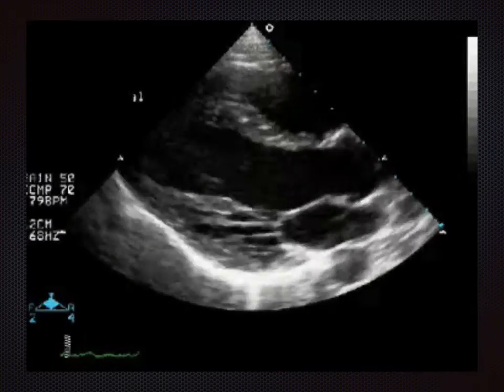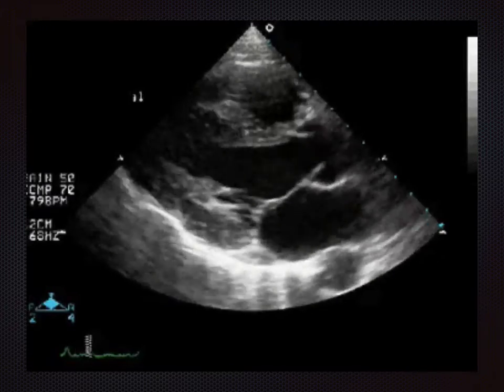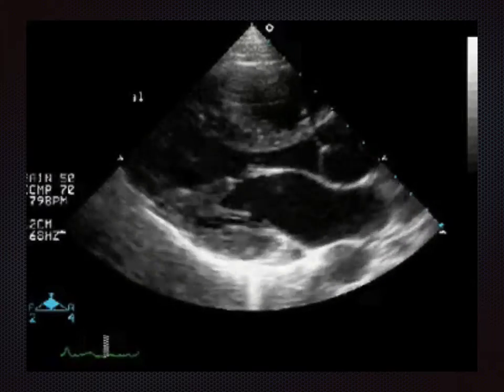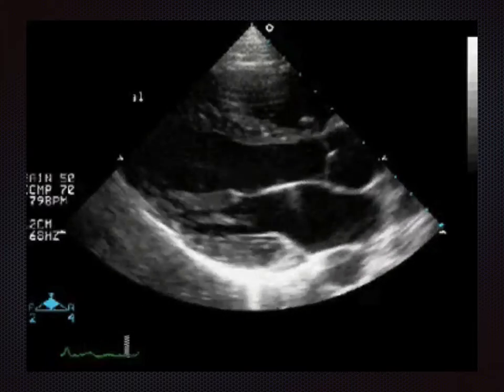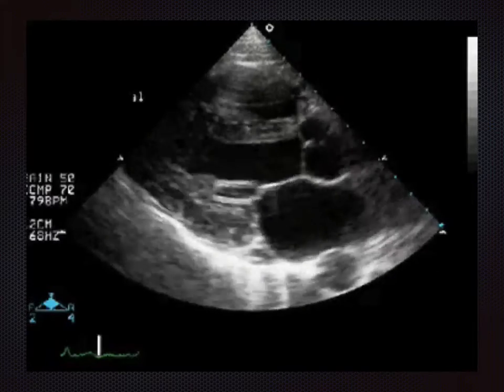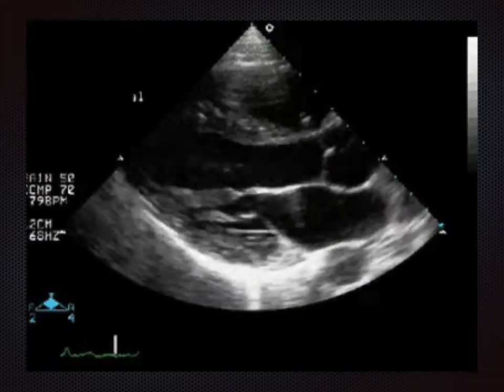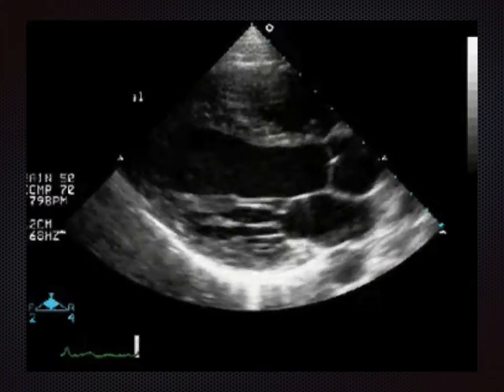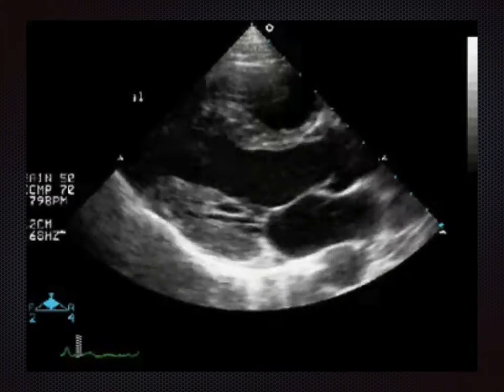So there are papillary muscles making the actual border of the posterior part of the heart on the bottom left, difficult to totally appreciate because of the chordae and papillary muscles around it. But on the whole, the left ventricle muscle, if you think about it, should be in its relaxed phase, i.e. when it's not contracting, about a centimetre.